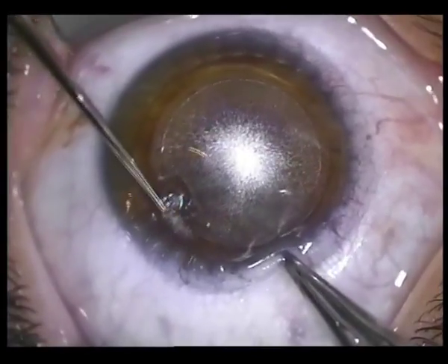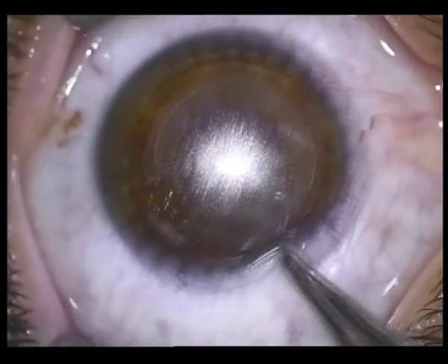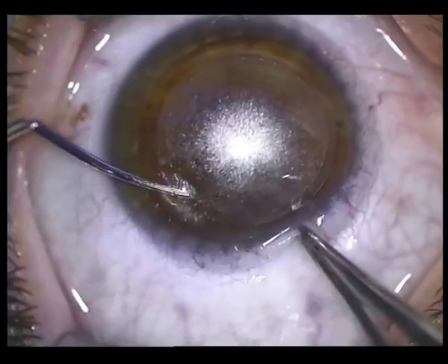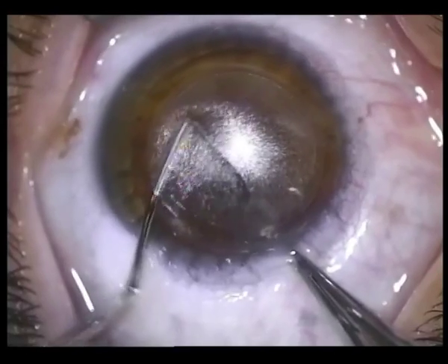The manual portion of the procedure consists of delineating the upper and lower aspects of the lenticule border, separation of the superior and inferior lenticular surfaces, and extraction of the lenticule through the 2 mm keyhole incision.